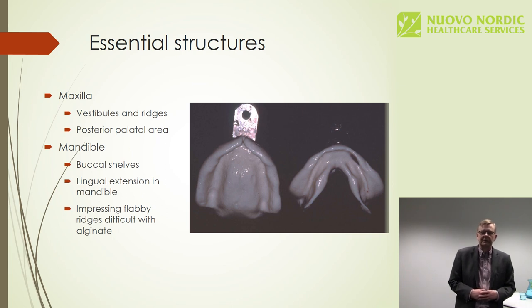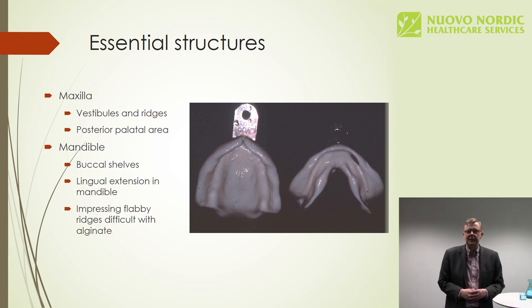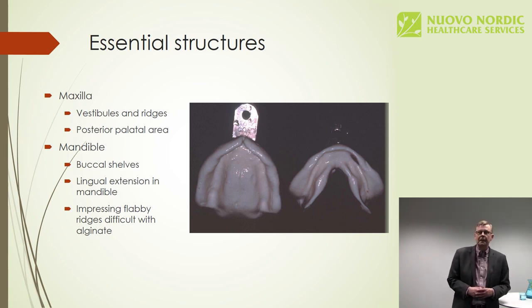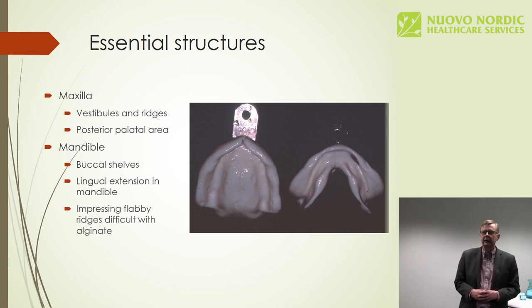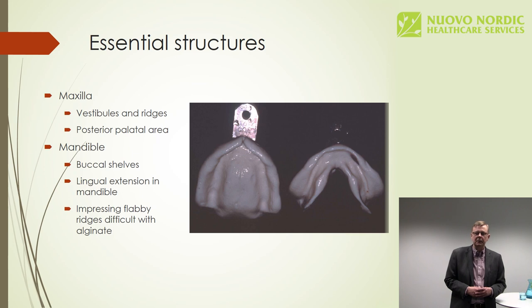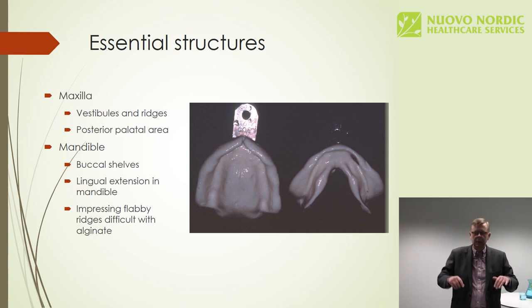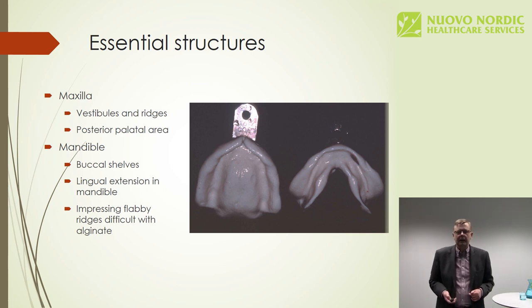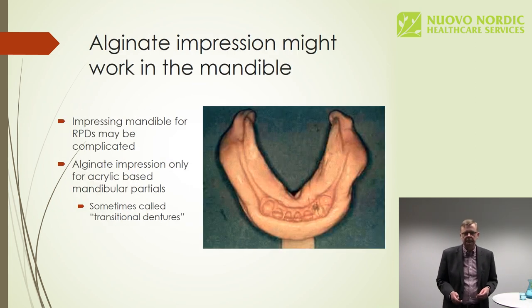So, in the preliminary impression we should see the essential structures of the mouth, especially in the mandible. Now, as we are going to use the preliminary impression for the final cast, you should see the buccal shelves, which are the major weight-bearing areas in the mandibular denture, and also the lingual extensions, where we more or less would extend the lingual flanges of the denture. In the maxilla, we'll use this impression only for the fabrication of the custom tray.